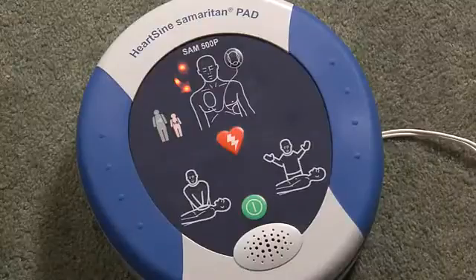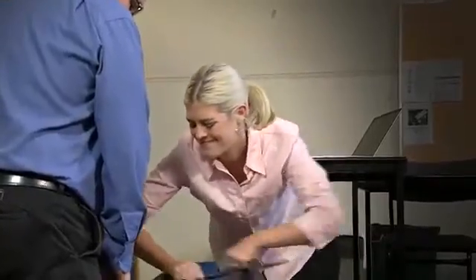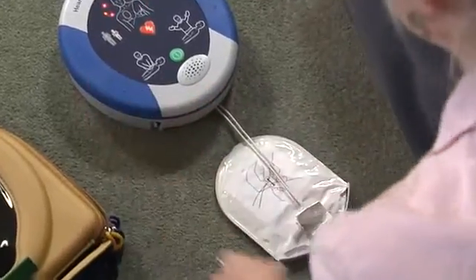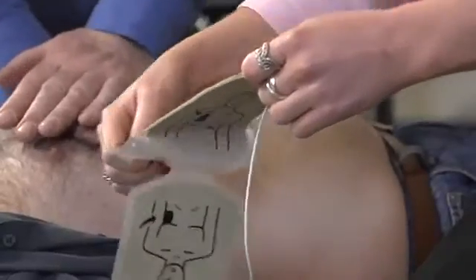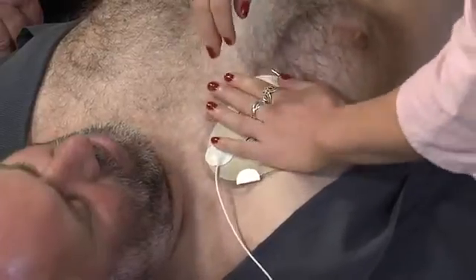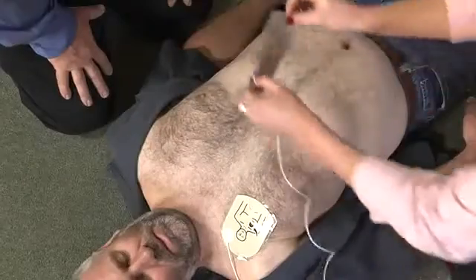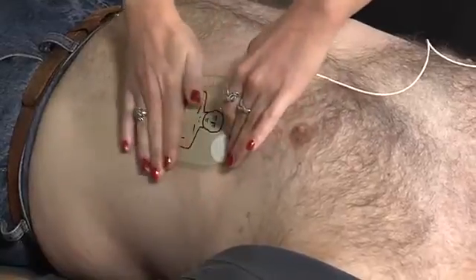Adult patient — call for medical assistance. Remove clothing from the patient's chest to expose bare skin. Pull the green tab to remove pads, peel pads from liner, and apply pads to the patient's bare chest as shown in the picture. Press pads firmly to bare skin. Shave hair from the patient's chest if necessary, and ensure the chest is dry and all undergarments have been removed.